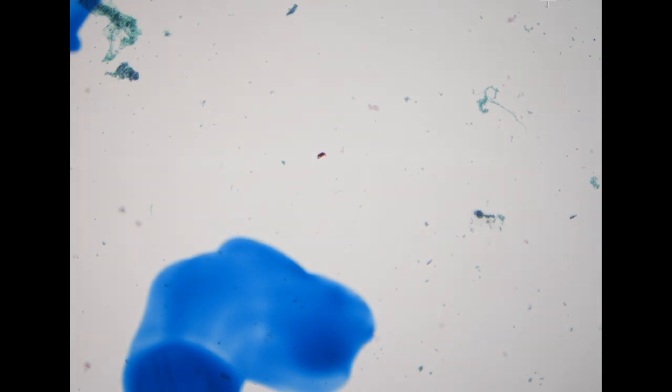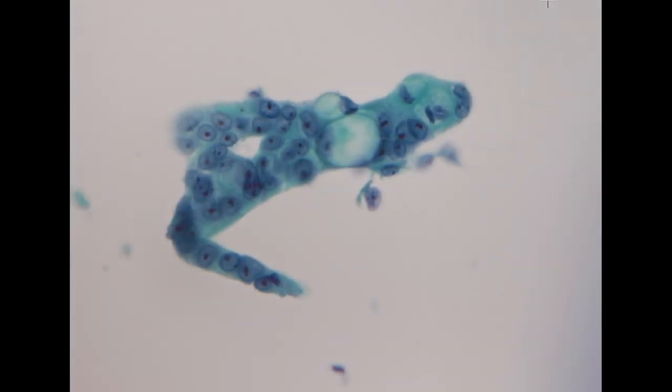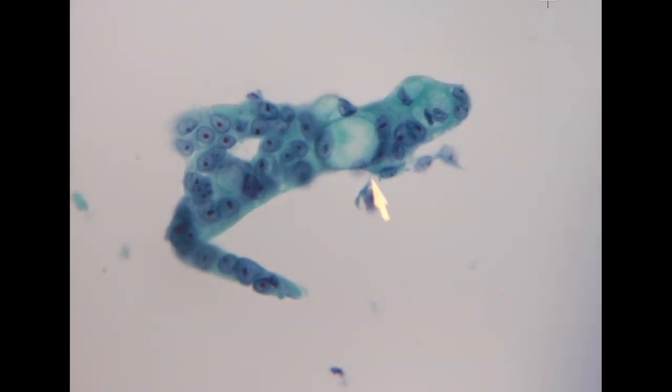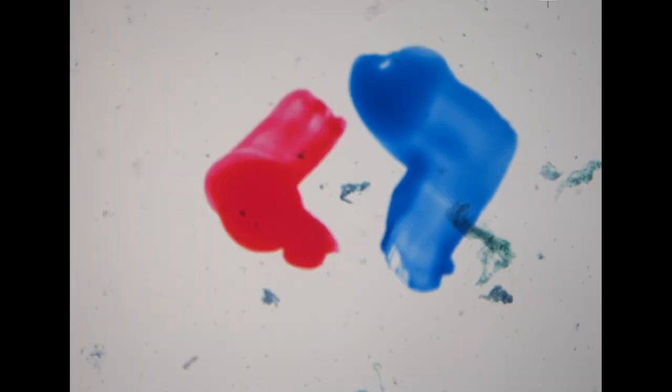The next specimen is a pancreas EUS-guided aspiration. So this one is relatively easy because you see the high-grade morphology. The cells are arranged in a large cluster with a glandular pattern. There are large vacuoles in the cytoplasm. So this is adenocarcinoma of the pancreas.